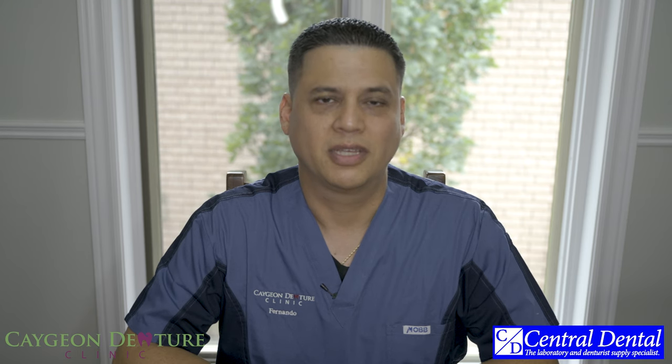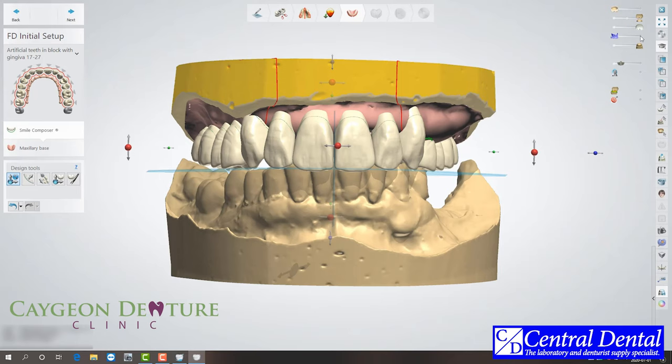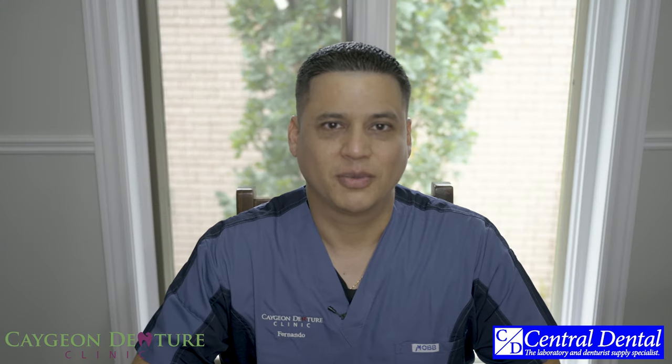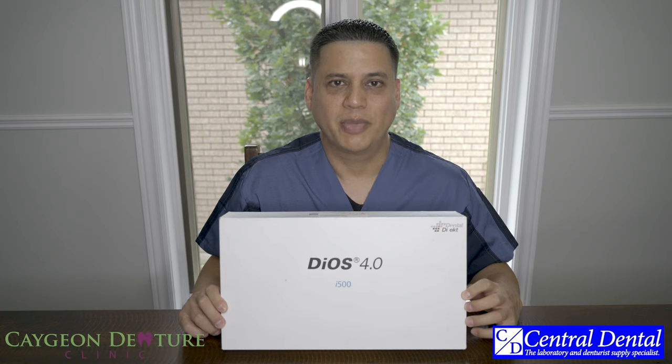Hello everyone, my name is Fernando and I am the owner and denturist at Caygeon Denture Clinic. Today I will be talking to you about a great product that will make it easy for you to enter into digital dentistry. I would like to say thank you to Central Dental Supplies for letting me borrow and use this great product. Today I'll be talking to you about the DIOS 4.0 intraoral scanner, otherwise known as the Medit i500.